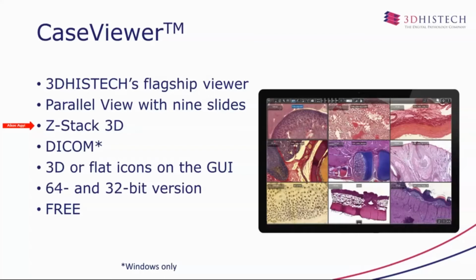Our viewer was designed originally to open our MRXS digital slides, but nowadays we can open third-party slide formats such as digital slides converted to DICOM. The graphical user interface of this software is easy to use.